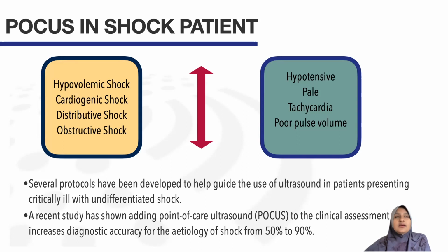Having said that, some of our patients may also have more than one diagnosis, and that further challenges our assessment and management of the patient. So in order to assist clinicians in early diagnosis and hence provide early management of the patient, several protocols have been developed to help guide the use of ultrasound in patients who present with undifferentiated shock.